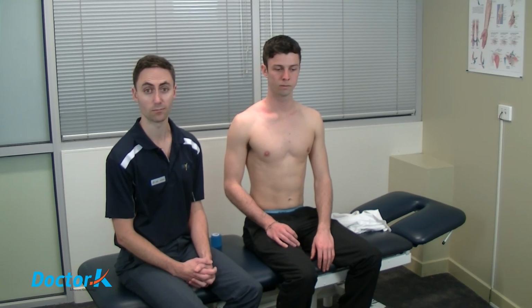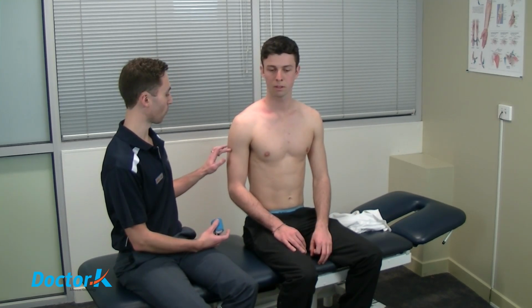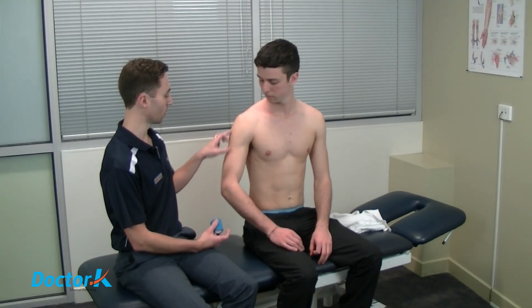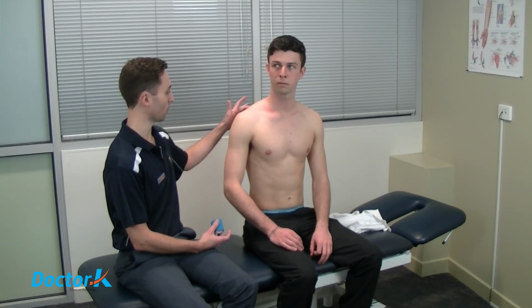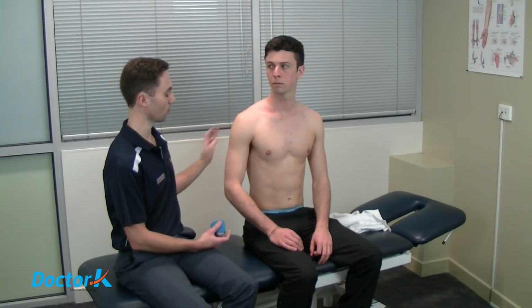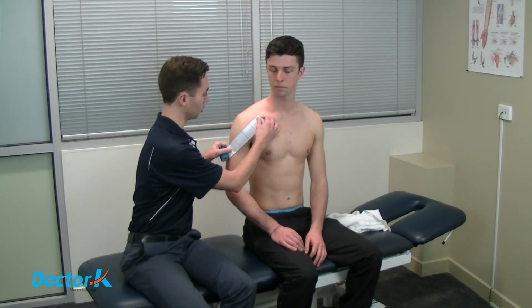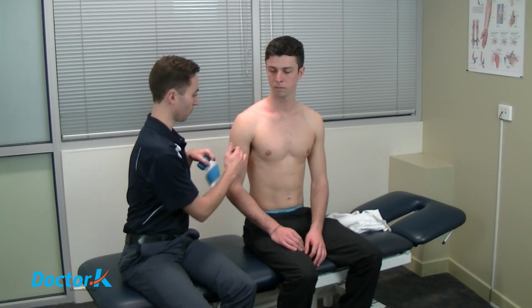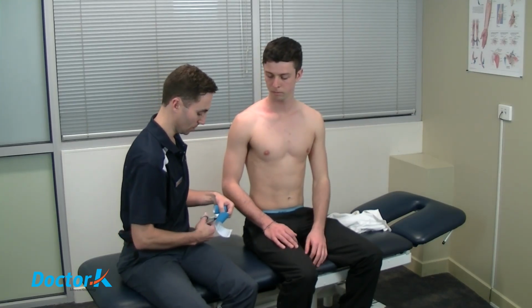So with this particular application, we're going to run a piece from the point of your arm where your deltoid muscle inserts down here, up around the front, another one up around the back, and we're going to cross the actual shoulder itself on that point of your shoulder from front to back. So we're going to measure a piece that runs from that point to just below your collarbone, allowing for the fact that the area will stretch, the tape will stretch a little bit as you come around.